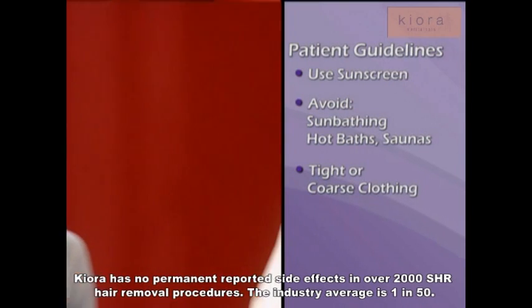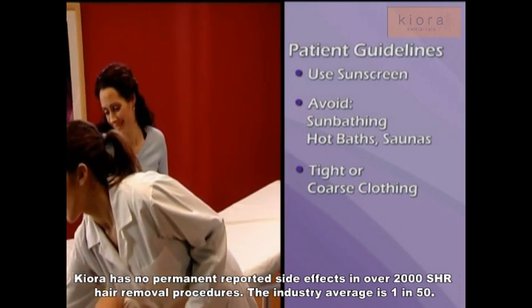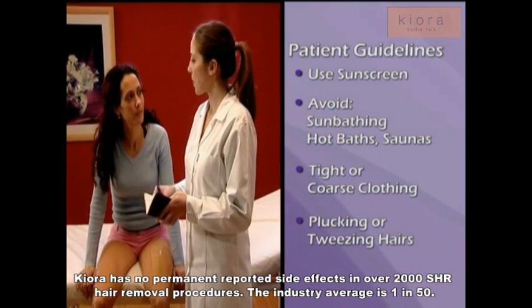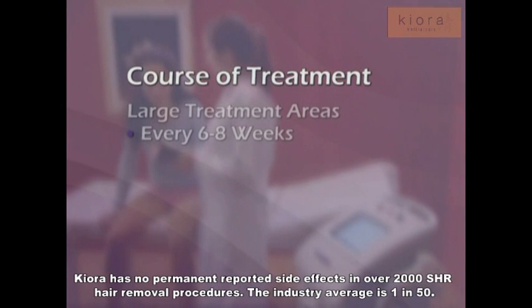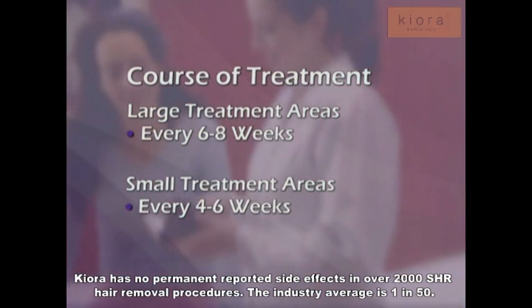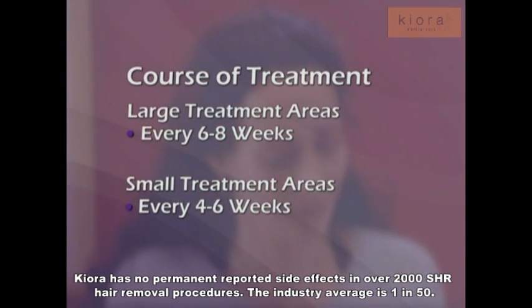Your patient should expect to observe some normal shedding of hair in the treatment area within seven days. If the patient observes any regrowth of individual hairs, she should not remove them by plucking, tweezing or any other means during the entire course of treatment. For large treatment areas, the interval between treatments should be six to eight weeks, while for smaller treatment areas the interval should be four to six weeks. The average number of total treatments is between six and eight, and sessions are typically from 20 to 40 minutes long, depending on the treatment area.